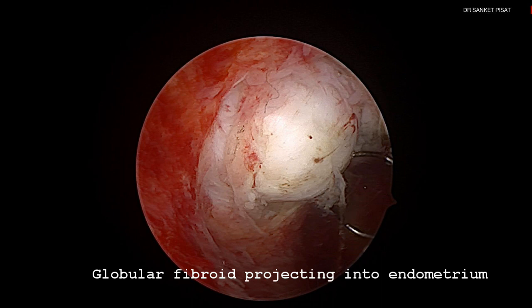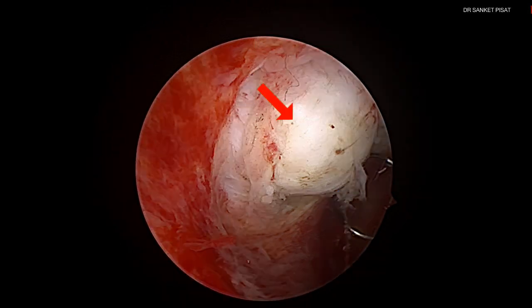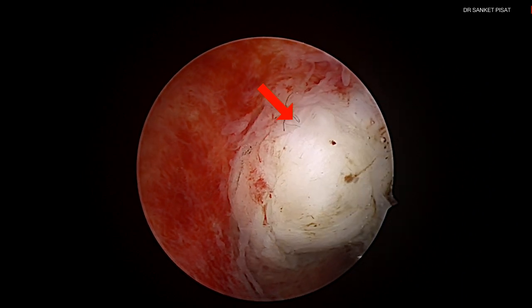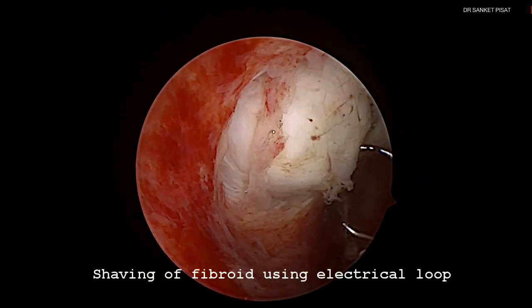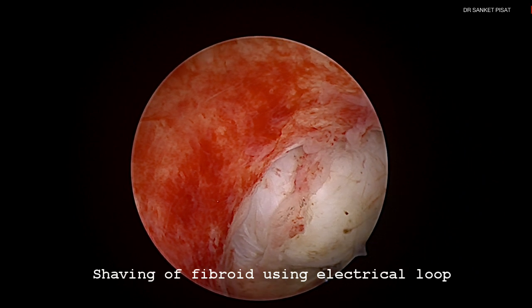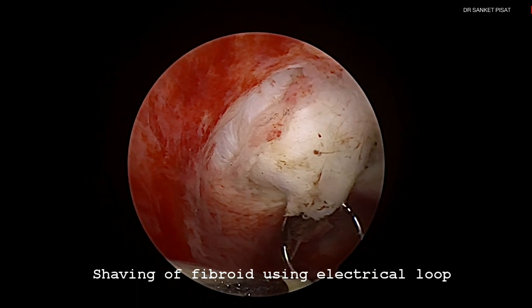Here we see one such globular fibroid which is seen to be projecting into the endometrial cavity. This area has been marked out by a blue line for reference. This globular fibroid has to be first detached from its attachment to the normal uterine musculature. Hence, using an electrical loop, shaving of the fibroid is carried out, also known in medical terminology as resection of the fibroid.